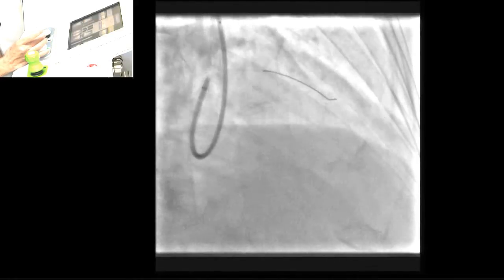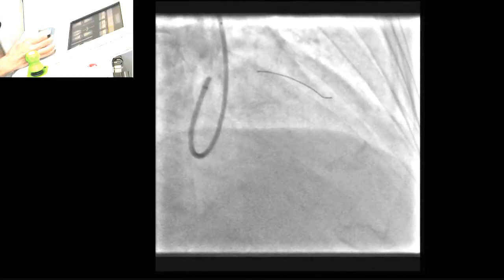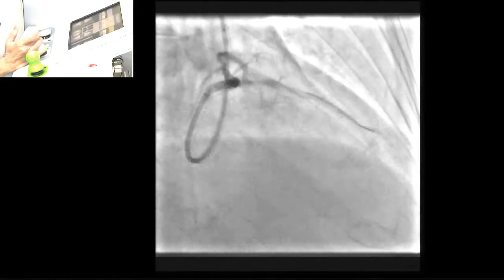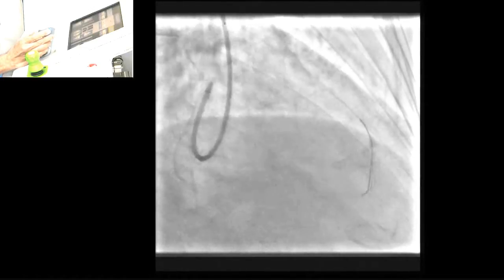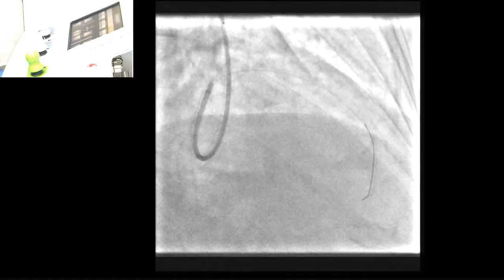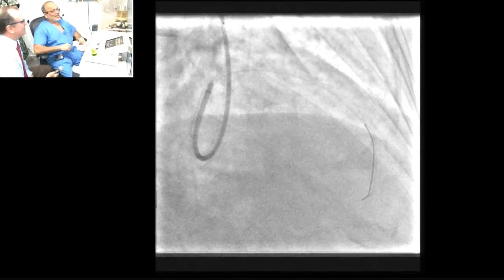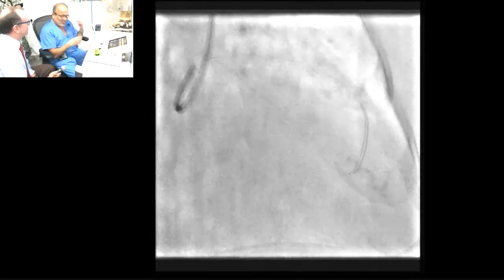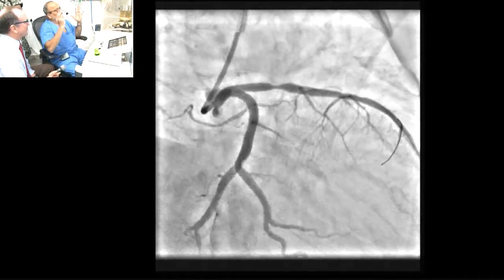It's important to emphasize: you do not get any physical feedback about resistance to the wire — only visual feedback. This is what we as attendings have to rely on when our fellows are working, because we can't feel the wire either. But we can usually tell something is going wrong by the way the wire is behaving. When going through a complex segment, I rely very heavily on my balloon. So it may be that we overemphasize the physical feedback of the wire.